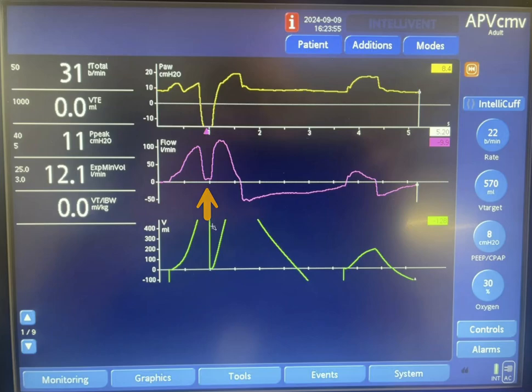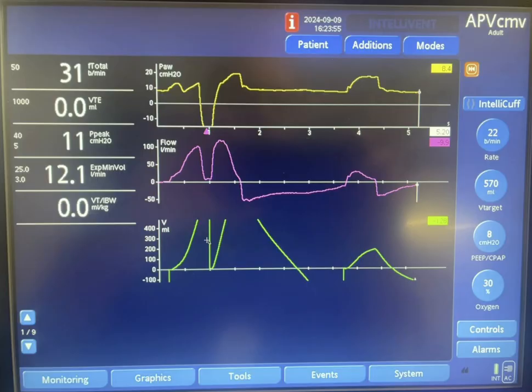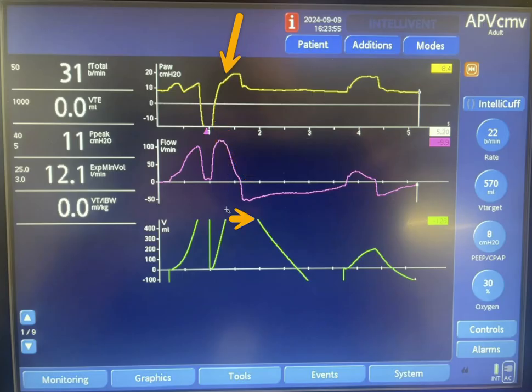The fact that the volume curve went down to zero here is because of recalibration of the machine — it's not because of exhalation. So what we have inside the lungs right now is around 550 mL. The next breath starts here, and the machine delivered pressure and the flow is larger than the flow in the first breath.